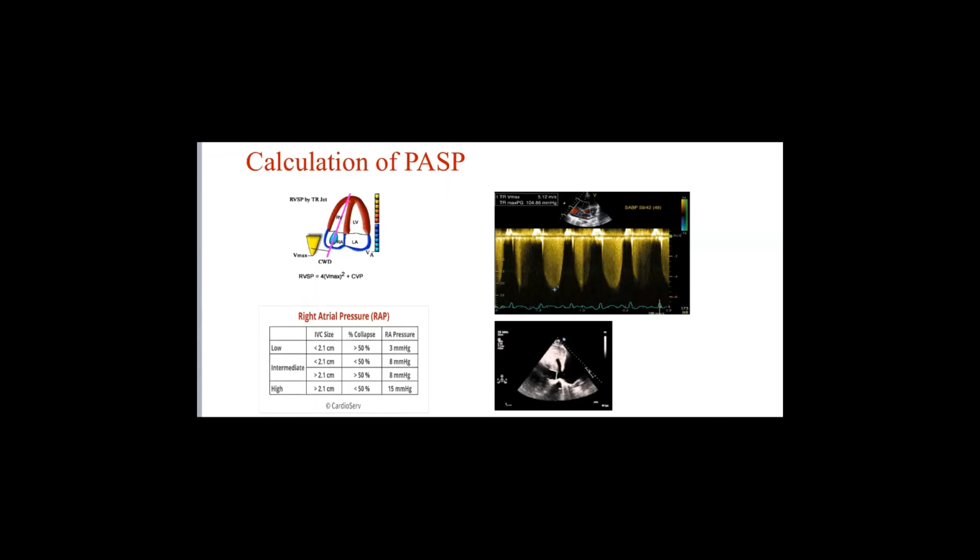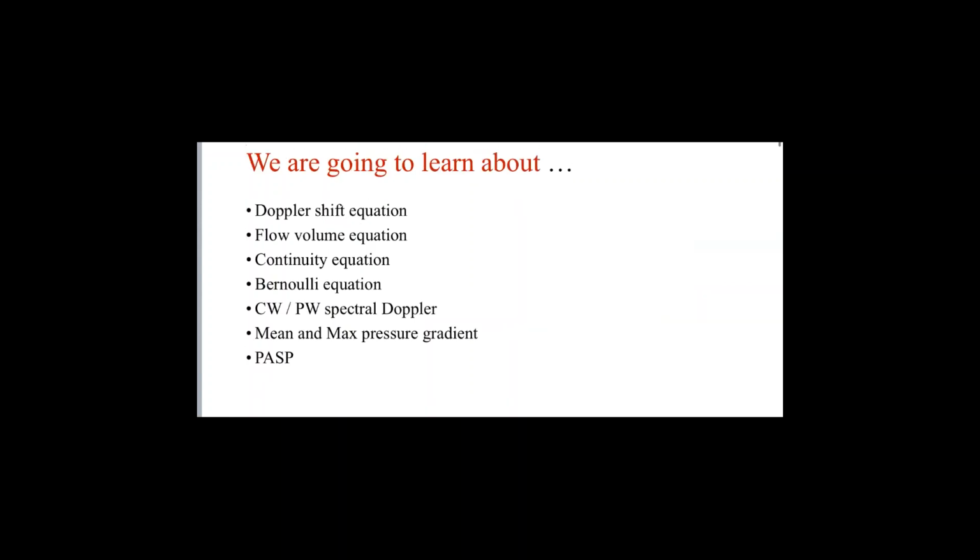Okay, so I think that's it. These are the four equations of Doppler that we agreed to work through tonight: the Doppler shift equation, the flow volume equation, continuity, and Bernoulli. These are the four main equations you have to grasp and know about. And if you have any questions, I'm ready.